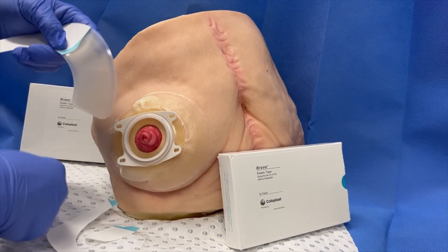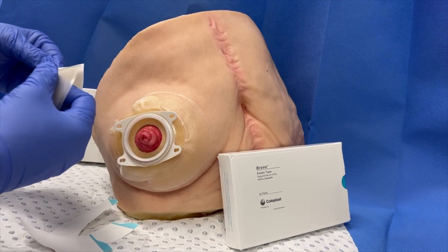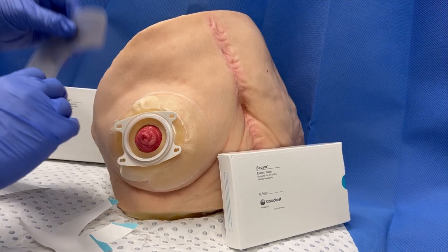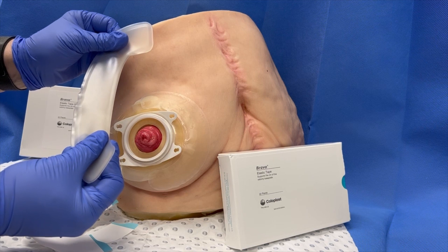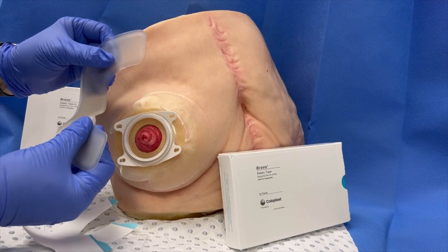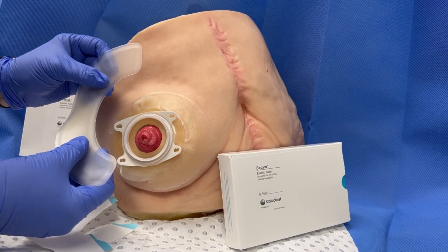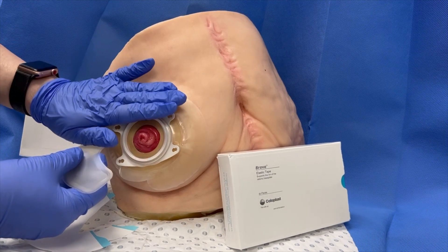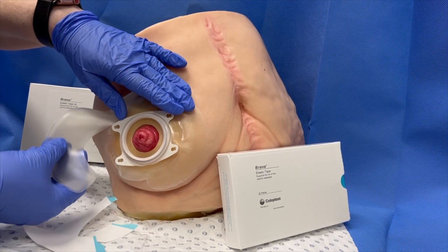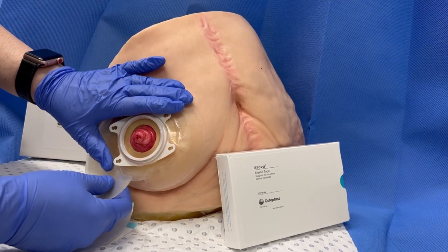Just remove the blue tab. Don't be tempted to stretch the tape, as it has memory and will retract to its original size. This can cause shearing and damage to the skin. So we just guide the tape gently.